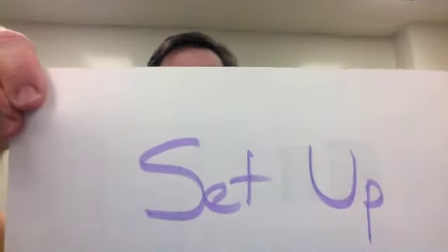So welcome to the setup. You should have read through the introduction, which talks a little bit about the origins of EKGs. And now we're going to be ready to start attaching our equipment. Some of this will already be attached when you come in, or another group will have done it, but I'm going to show you just a little bit about what we're talking about.